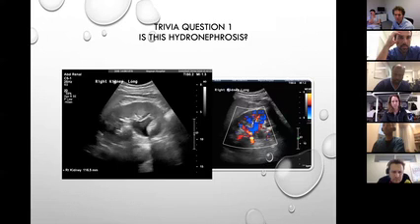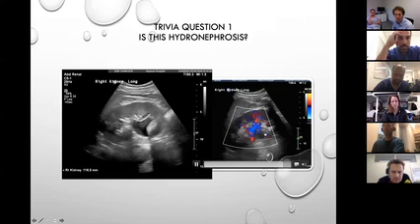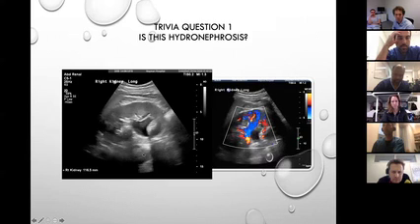So that's not a blood vessel that we looked at. That is definitely something else, isn't it? Yeah, got it. So there's no flow in that structure there. All right, so far good. But if you look at this side of the kidney, this half of the kidney didn't have that problem. It's just almost at the inferior pole, sitting in that region there.